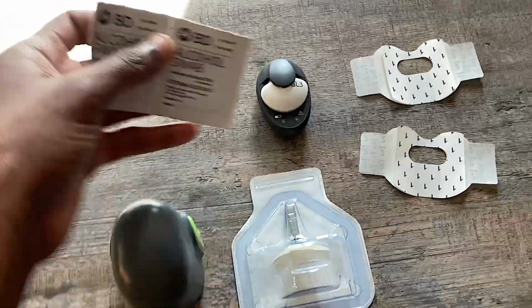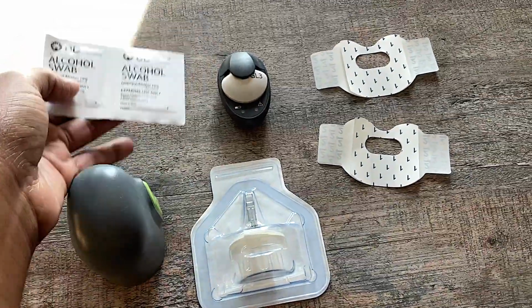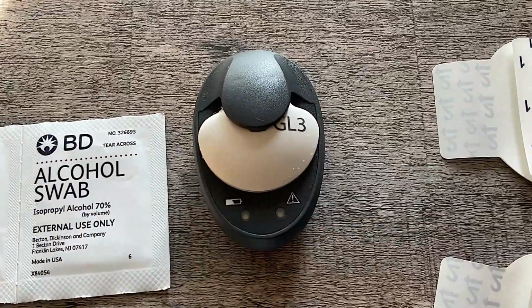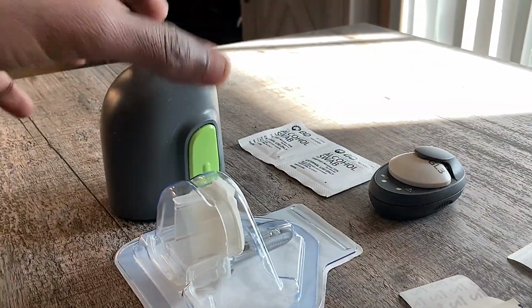We're also gonna need an alcohol swab because we're going to wipe the area before we apply any of the products. It also makes the tape stick better because it's not sticking on anything that is greasy, like lotions or anything like that. So that's helpful.